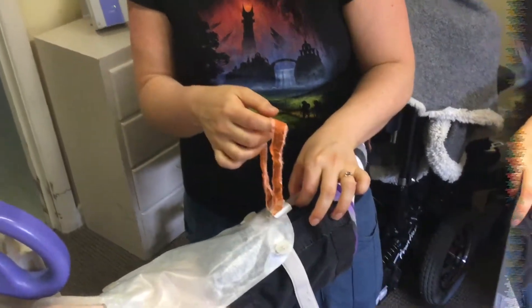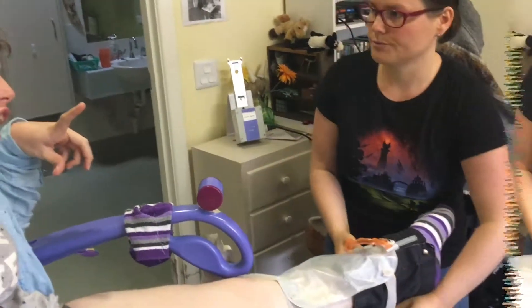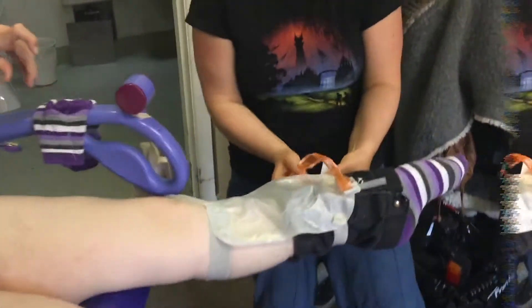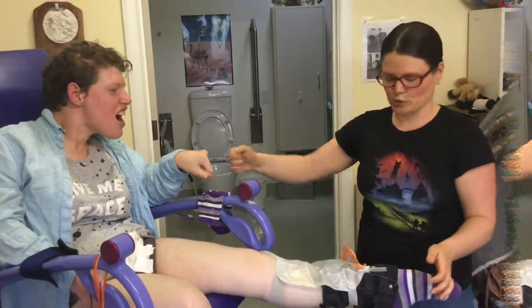That allows Sam to grab the ribbon and open the catheter bag herself, so she can empty it independently. The strap also loops through — loop that through — and then I'm doing up the velcro. That's it, done.